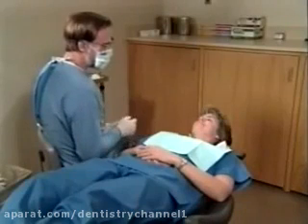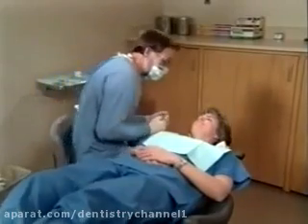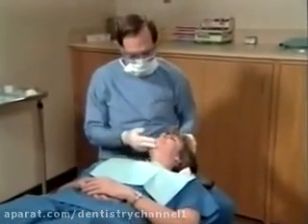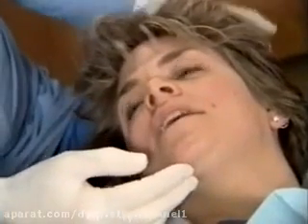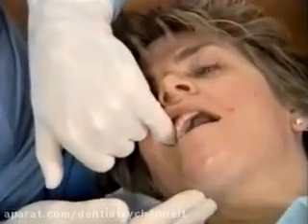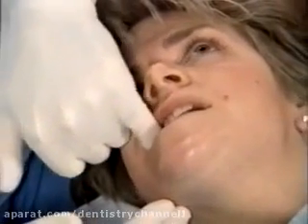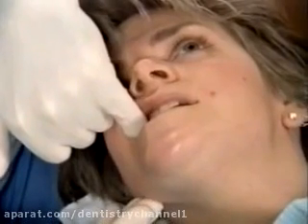For a right-handed operator performing a right or left posterior superior alveolar nerve block, the clinician may be seated in the 11 o'clock position with the patient's neck extended and the head turned to permit visualization of the maxillary buccal vestibule. Once a finger has been placed in the vestibule, the mouth is partially closed and the jaw is moved laterally to the side of injection. This maneuver relieves tension on the cheek and moves the coronoid process away from the injection area.